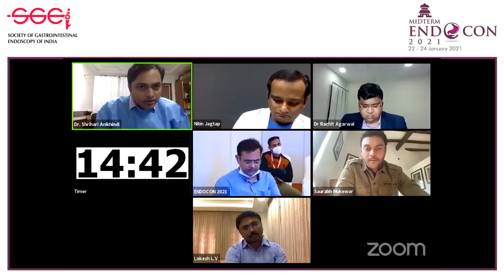After the endoscopy, for objective classification, it is essential that we have a pH study in all these patients. So I would like to make a distinction that we have availability of a simple pH study and we have a pH with impedance study. For documenting the patient as having reflux, the guidelines state that you need to stop the patient on PPIs, and using a simple pH study would be the gold standard for documenting abnormal reflux in these patients. So high acid exposure time is the criteria that is used by most of the studies to fit into these patients who have significant reflux.